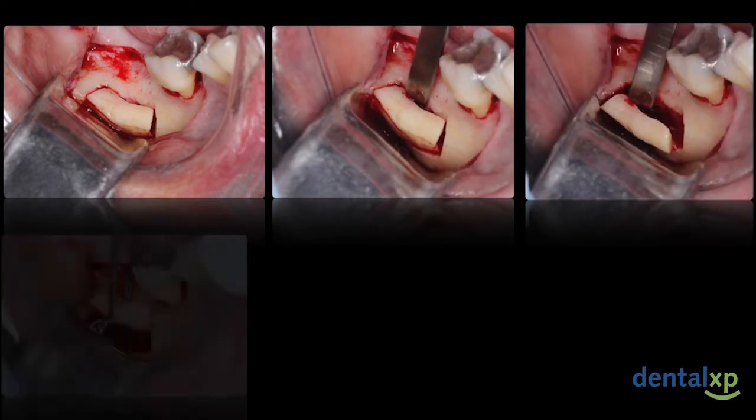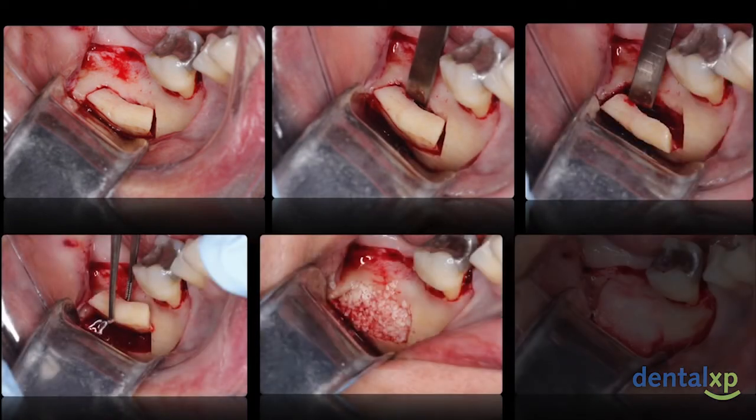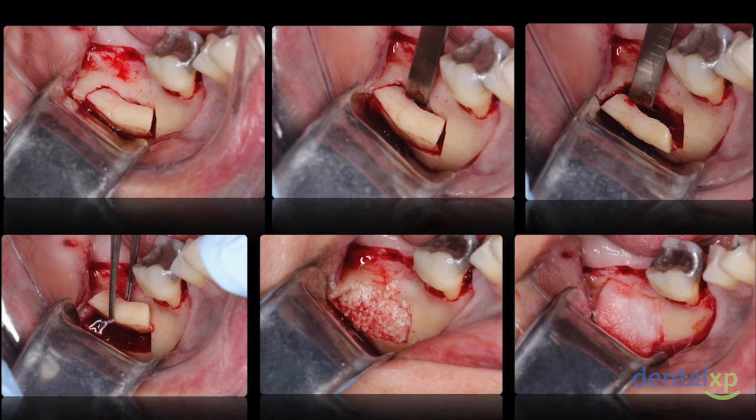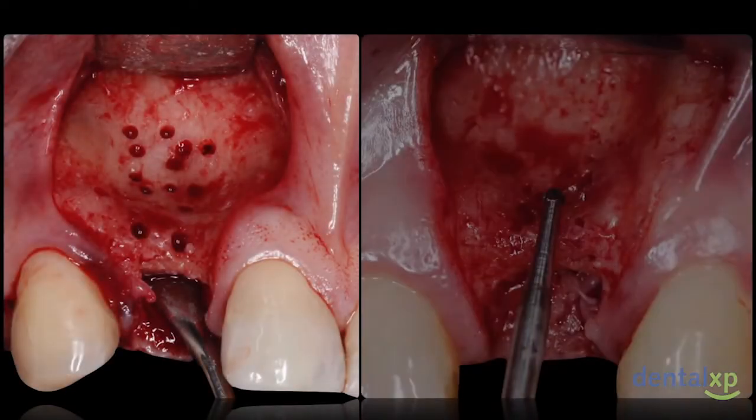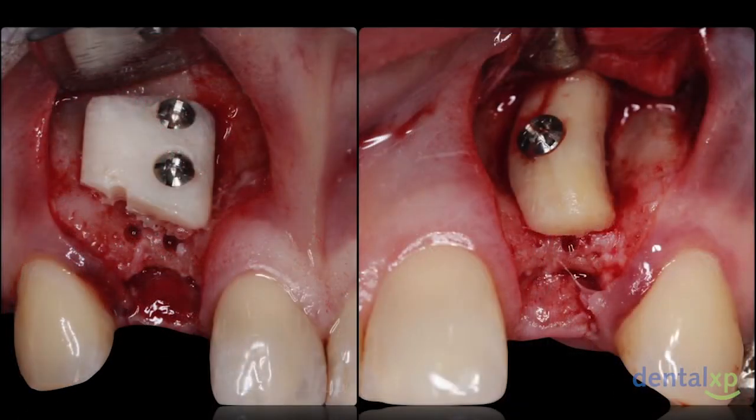The external oblique ridge was used as a donor site in this case. The block was outlined and cuts were progressed to the desired thickness distally, mesially, and on the occlusal aspects with the piezoelectric device, and an apical weakening of the inferior border of the block was performed in order to allow greenstick fracture and harvesting of a decently sized block with mainly a cortical component. Site preparation was performed in a similar fashion as discussed before, and the blocks were fixated in place.